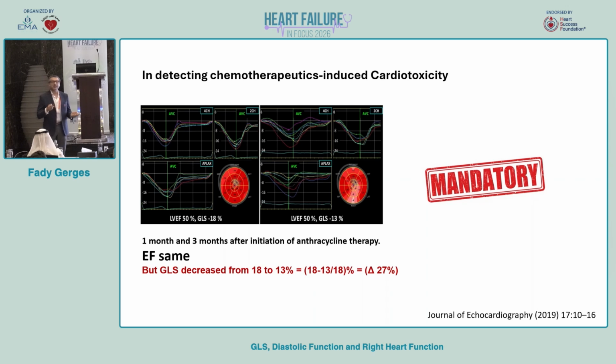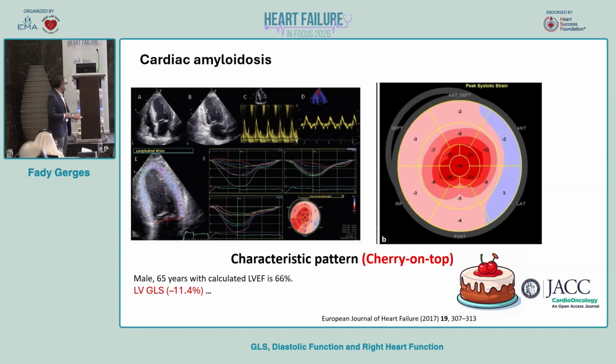So do not rely on the basic ejection fraction by M-mode or 2D, or on symptoms, when you assess these patients who are on cancer chemotherapy.